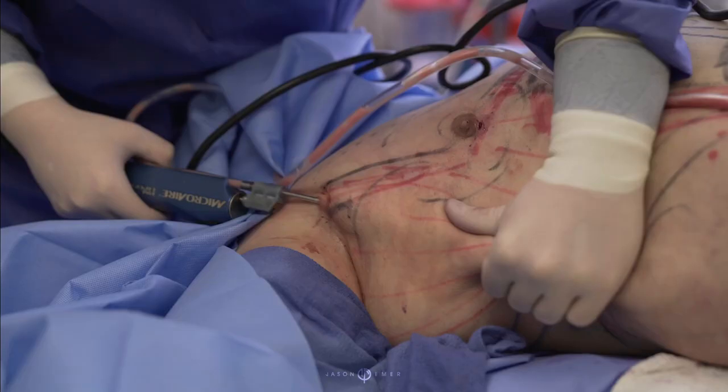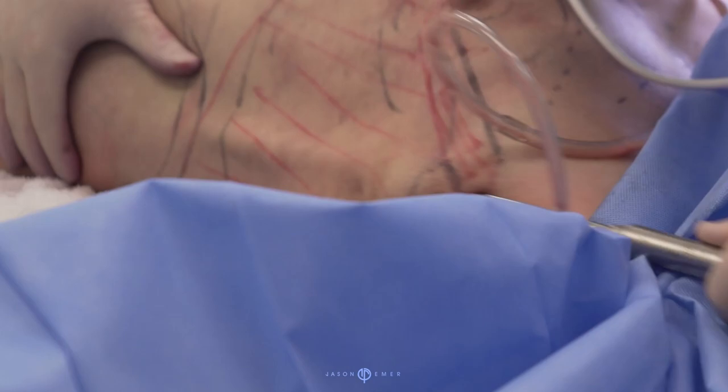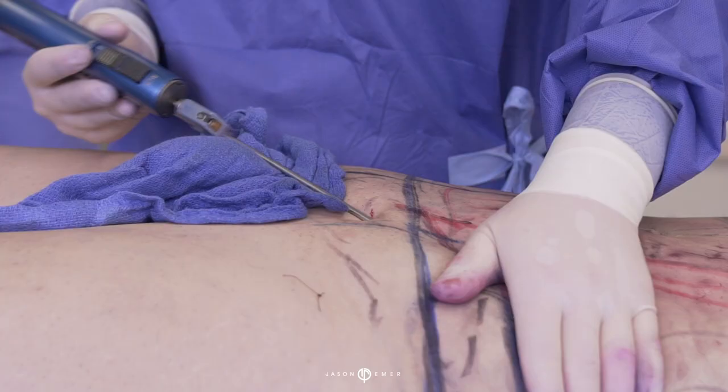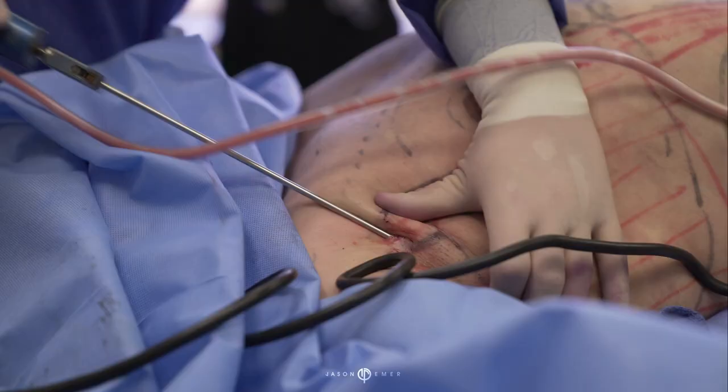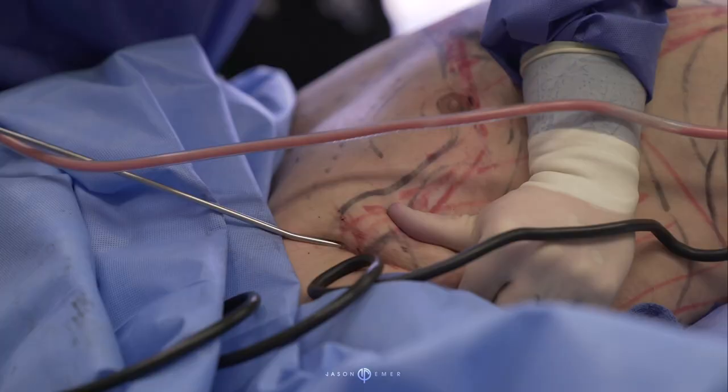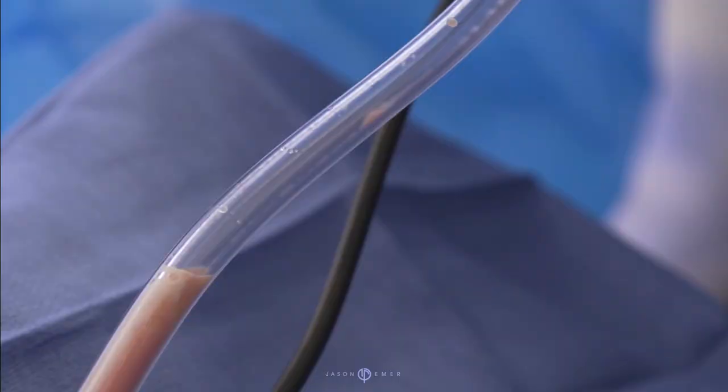The key here is to get as much as we can. We're debulking him right now. We want to get a lot of fat because he has a lot of sagging here, indentations from previous surgery. So we're really working, grabbing the skin, going in between there and literally suctioning out everything in this armpit side back roll area. Get as much as we can out of here.